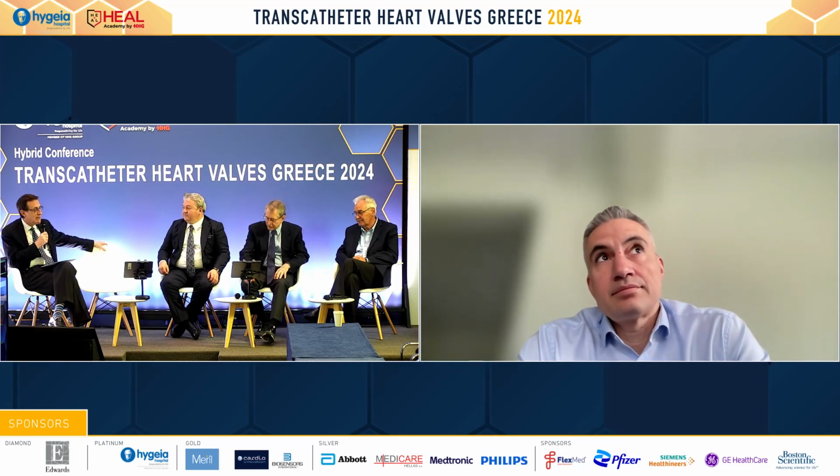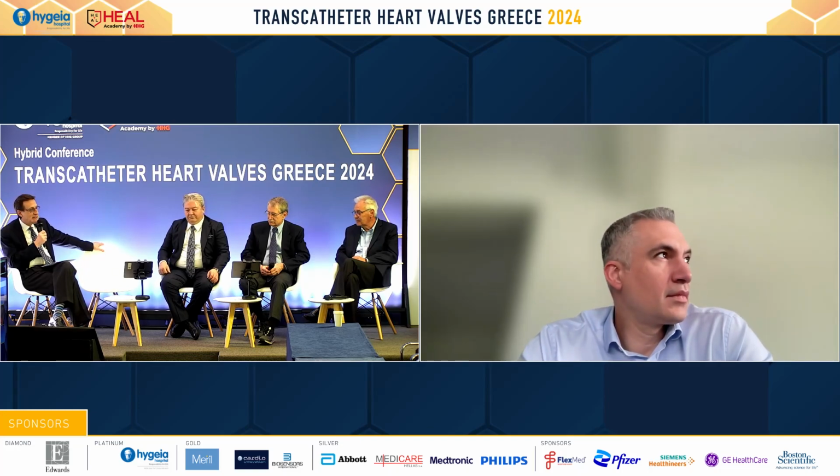Because all these alignments work well in the simulation perhaps, but while you are in the procedure, you look at the hat maybe or look at something else, and even the coronaries are not exactly aligned the same way in every patient. Perhaps we start from our surgeon that has much more experience with the patient variability of coronary ostia location, and how could we make some practical sense of all of those situations that we just heard?